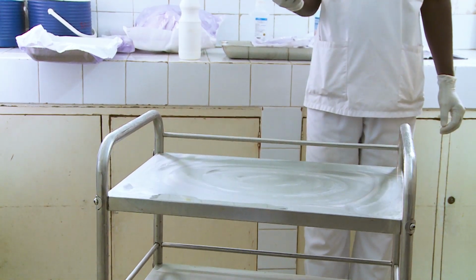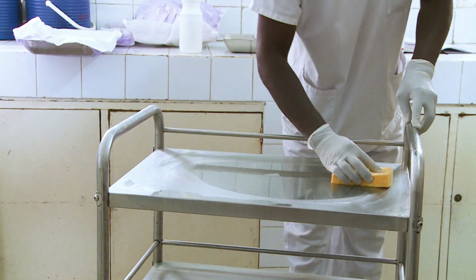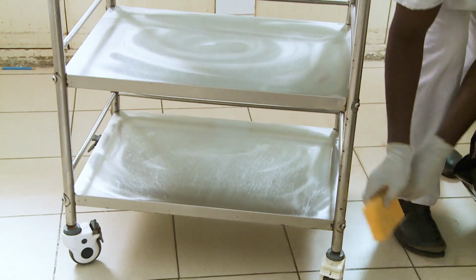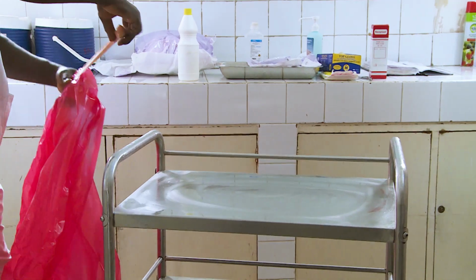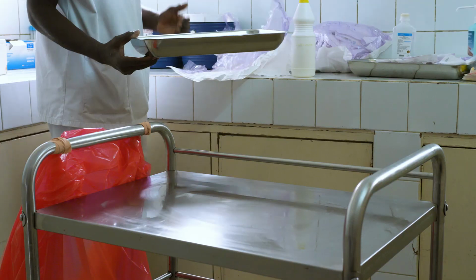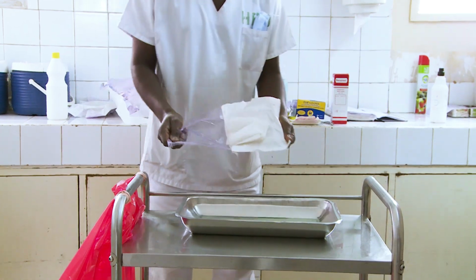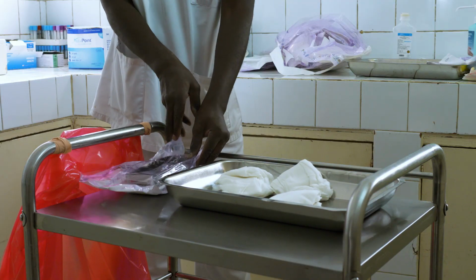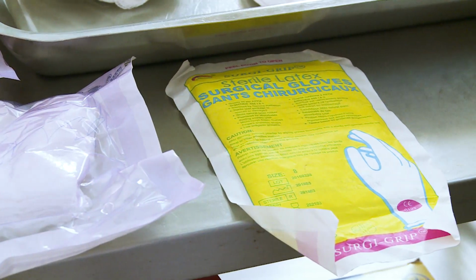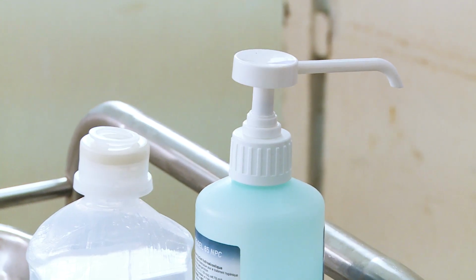The trolley surfaces and legs must be cleaned with clean warm water and detergent, then disinfected using alcohol or another non-corrosive disinfectant. Prepare the trolley by attaching a waste bag for waste collection. Then continue adding sterile field or tray, sterile swabs or gauze, sterile pack that includes forceps and container, sterile saline, sterile and non-sterile gloves, wound dressing and adhesive, alcohol-based hand rub.